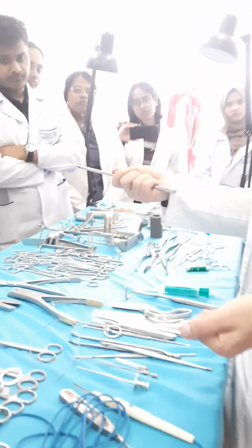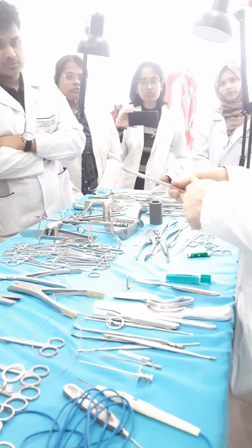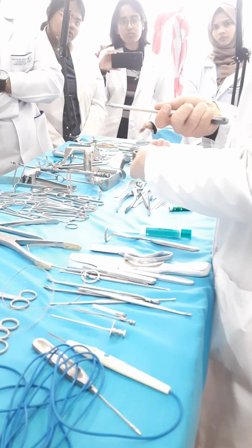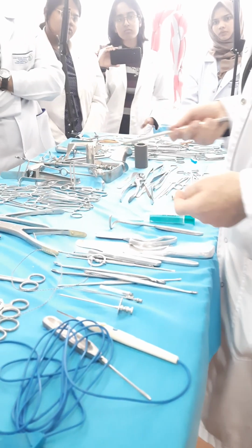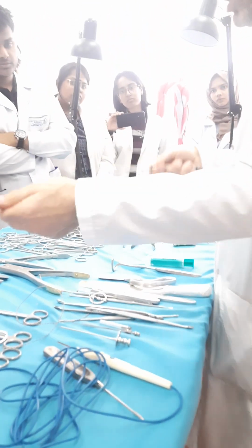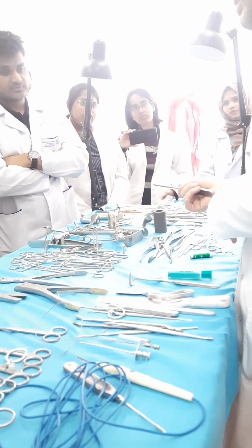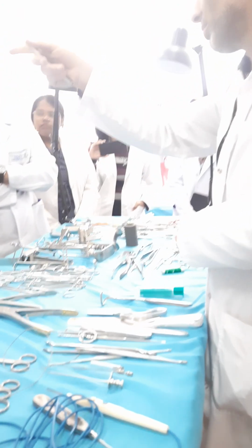A useful instrument, we call it the trocar. The trocar has a sharp piercing portion. It has an outer tube, and of course it has a cap. Let's say you remove it, in that position you pierce the cavity, you remove this stylet, and from this you make an artificial fistula. By fistula, if you feel bad, you can sit down.